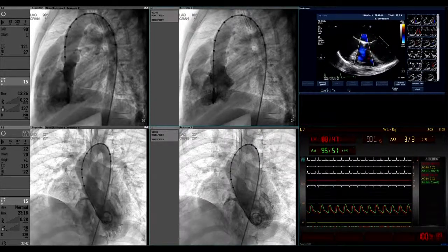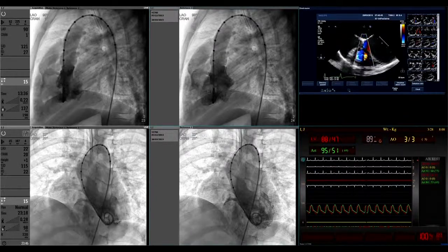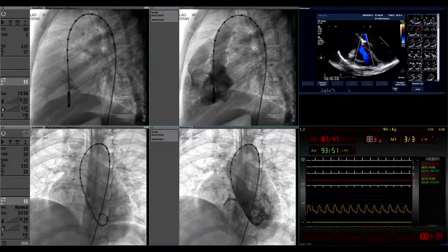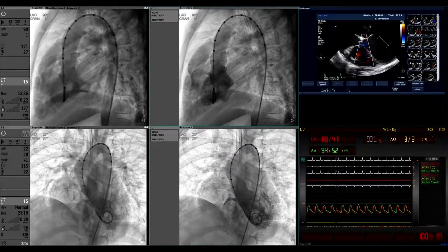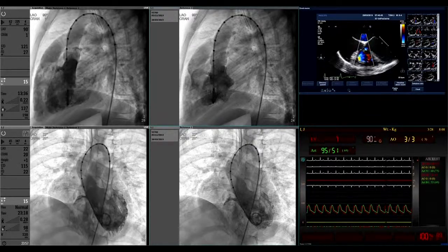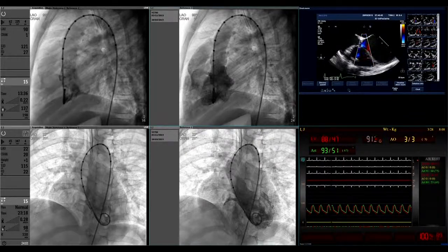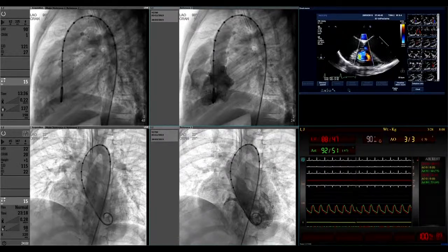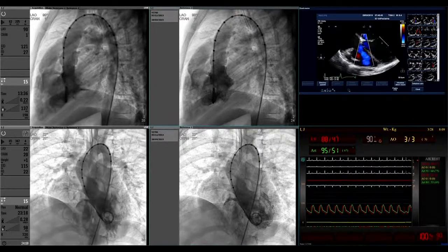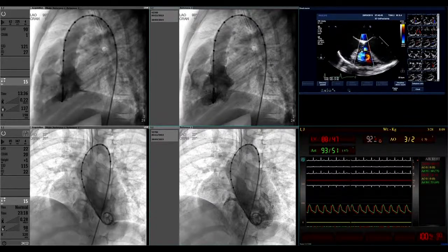Dr. Tin, as you said, the angiographic dimensions look smaller than what was predicted in the echo. What were the pulmonary artery pressures? There is no significant gradient across the pulmonary artery and the RV. The pulmonary pressure is normal and there is no pressure gradient from the RV to the RVOT. And it's not pulmonary hypertension.